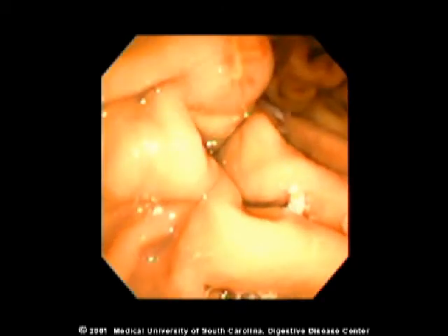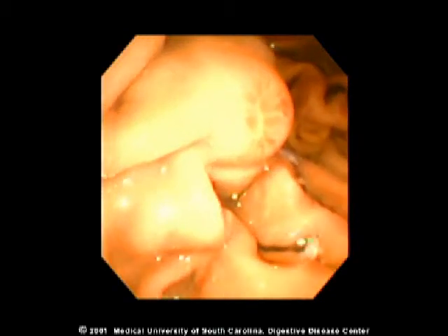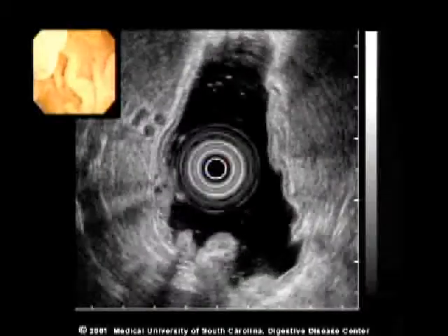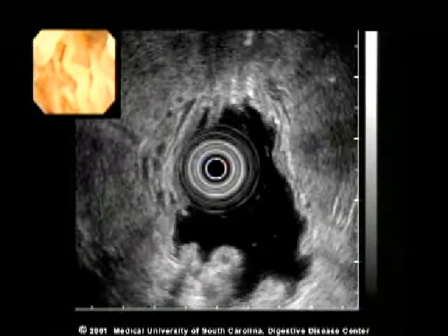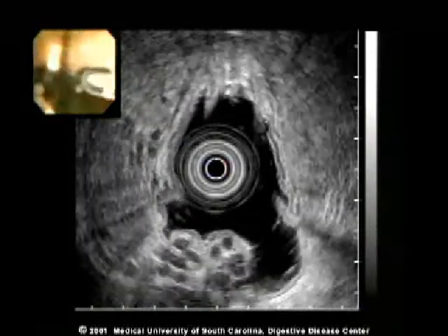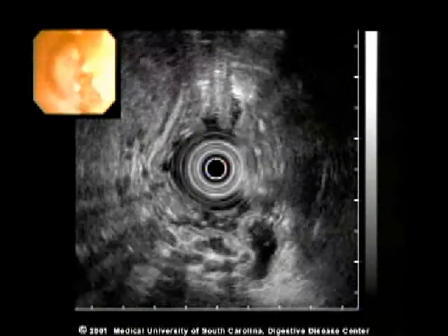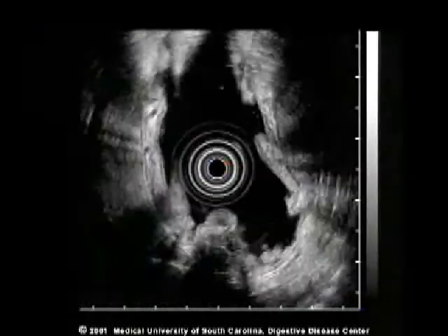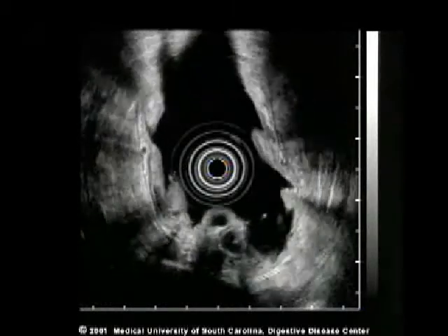Gastric varices can also be easily identified, and EUS is particularly useful in distinguishing between gastric varices and large gastric folds. Note in the bottom half of the screen the large anechoic vascular structures within the wall of the stomach. These are diagnostic gastric varices.